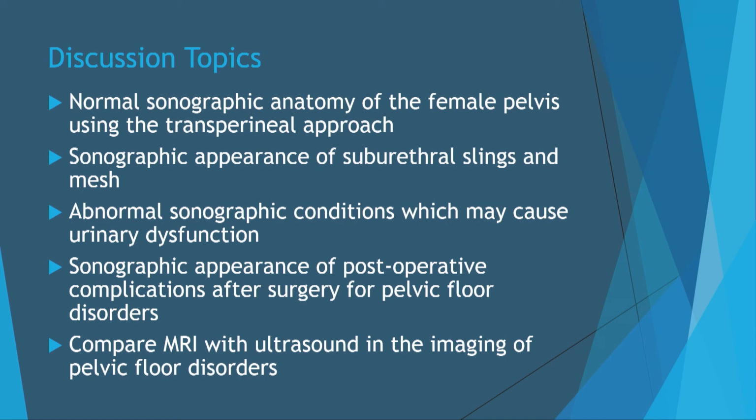In discussing the topic of pelvic floor imaging for disorders, I'm going to be covering the following topics. They include normal sonographic anatomy of the female pelvis using the transperineal approach, sonographic appearance of suburethral slings and mesh, abnormal sonographic conditions which may cause urinary dysfunction, sonographic appearance of post-operative complications after surgery, and then finally I'll discuss the role of MR versus ultrasound in the imaging of pelvic floor disorders.